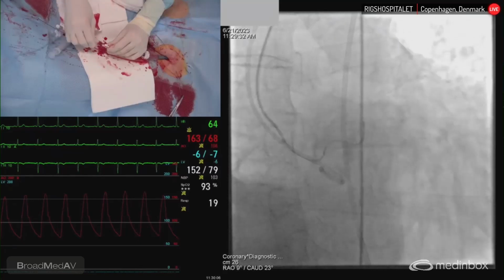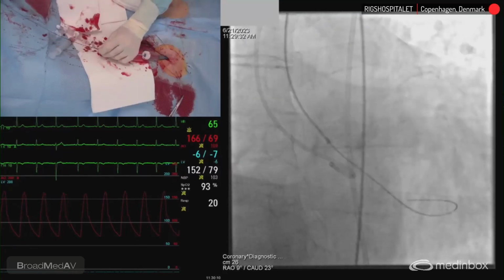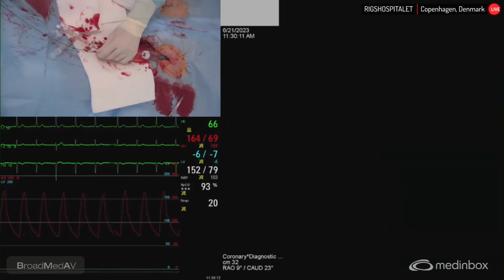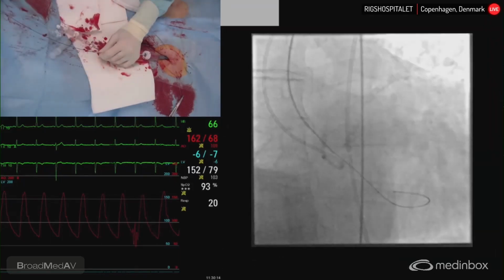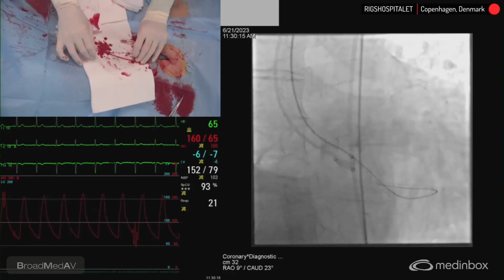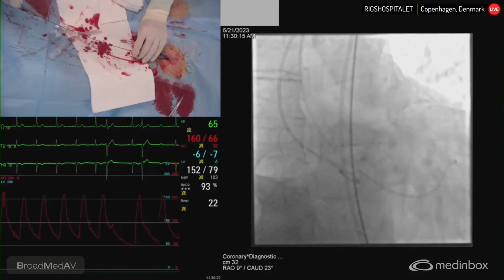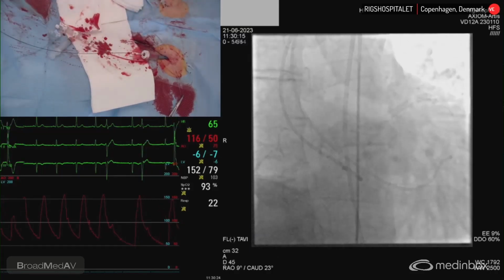It was a little lower than we thought, but the horizontality is the problem here. Now I'll go really deeper in with the wire. Let's see, make it slip out into my hands. Yeah, all right, good. Yep, right, you take over.